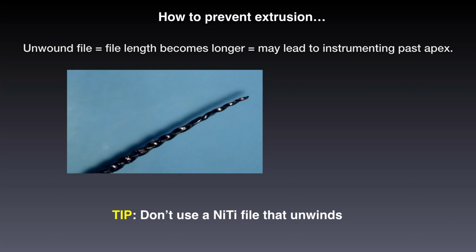Not to mention having that file push debris out the apex, post-op pain, complications with that, on and on. Nothing good comes out of a file that unwinds easily. Okay, so it's something for you to make note of when it comes to instrumenting.